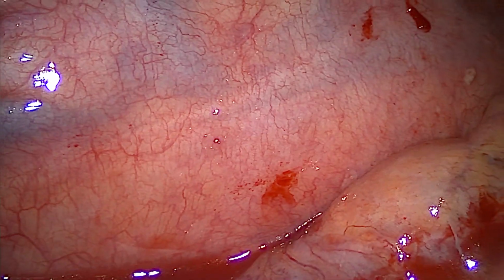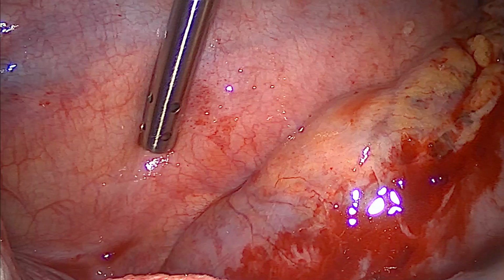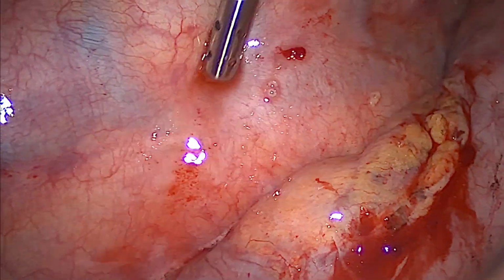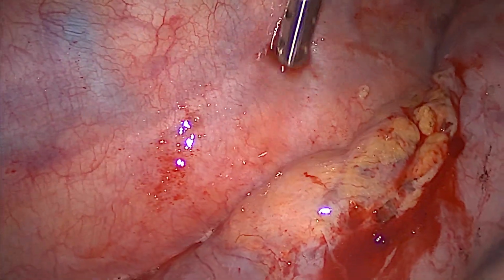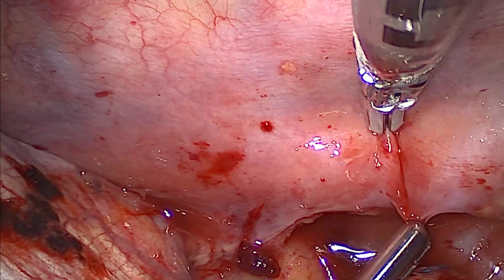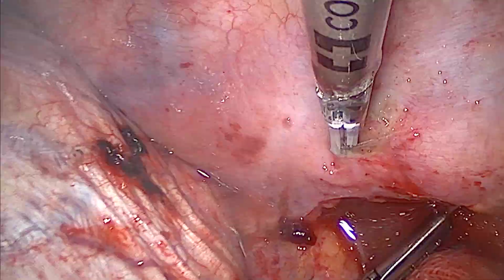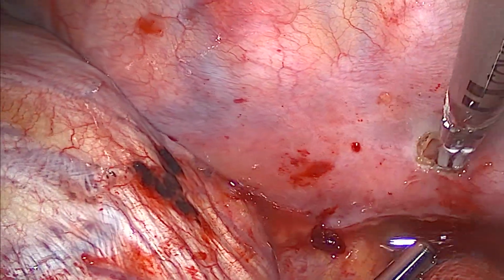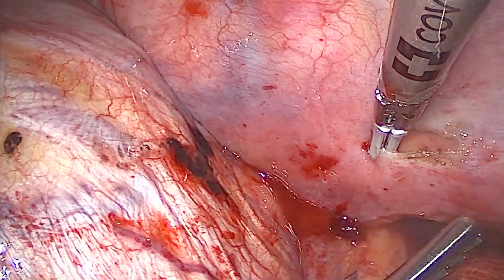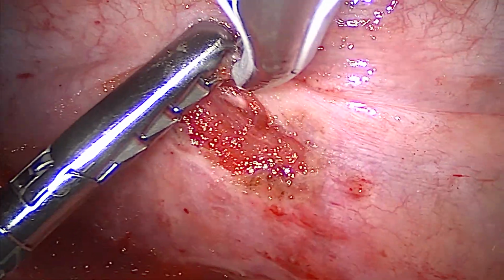As you would remember, there is the famous mnemonic about the thoracic duct's location. It's the duct between the two, between the oesophagus and the azygos vein, right in front of the aorta. You can see the azygos vein and the fat in front of the aorta, at which level we started carefully opening up the pleura in order to dissect the thoracic duct out.